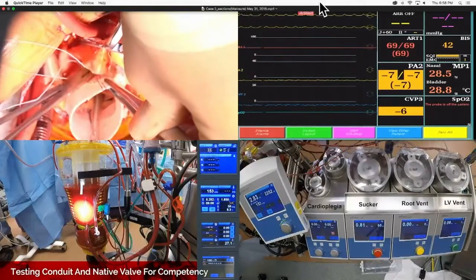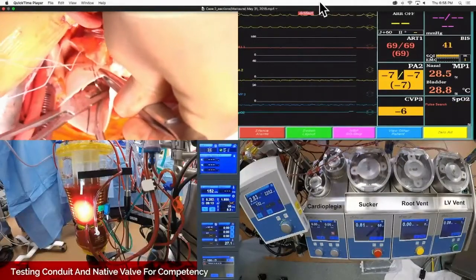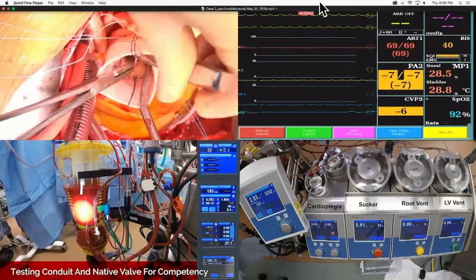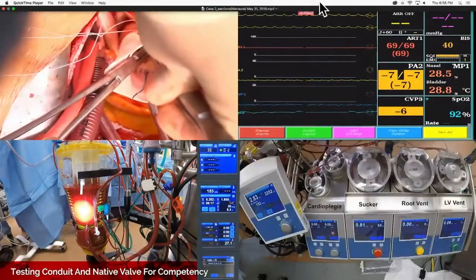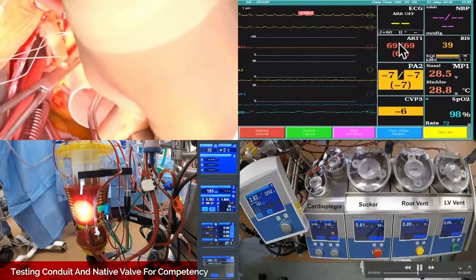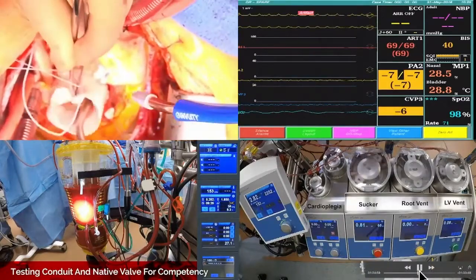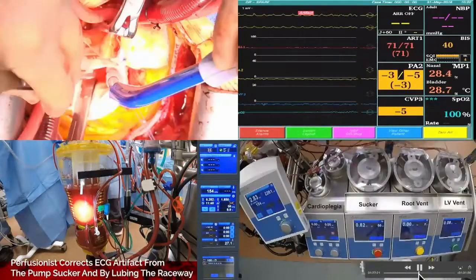No, wait till you see it work. Wait till you see this. No, this is good stuff. Do we have the lube in the tube? Where'd it go? Oh, we've got to go to 1 hour 27 minutes.